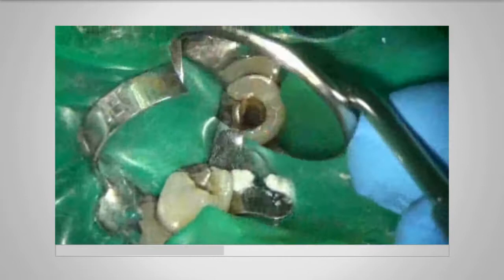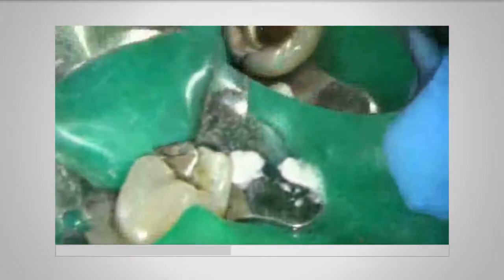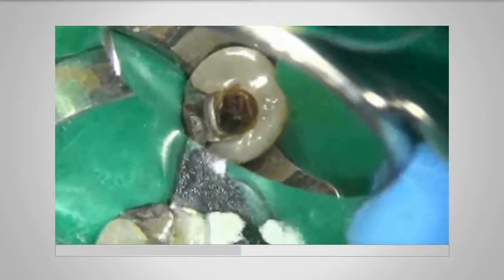Okay, on high power, we can just see the head of, in this case, a Hedstrom file in the root canal.